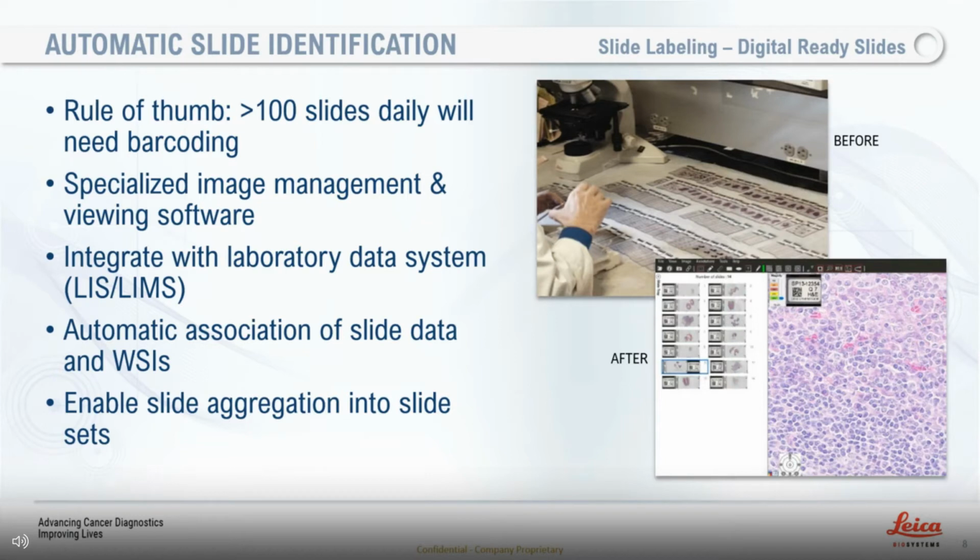And this is one of the areas where bringing digital pathology into a laboratory can add some extra steps to the lab, but it can also help alleviate some of those traditional steps, such as the case sorting, which can be done automatically. So there are some workflow benefits that can be realized there as well.